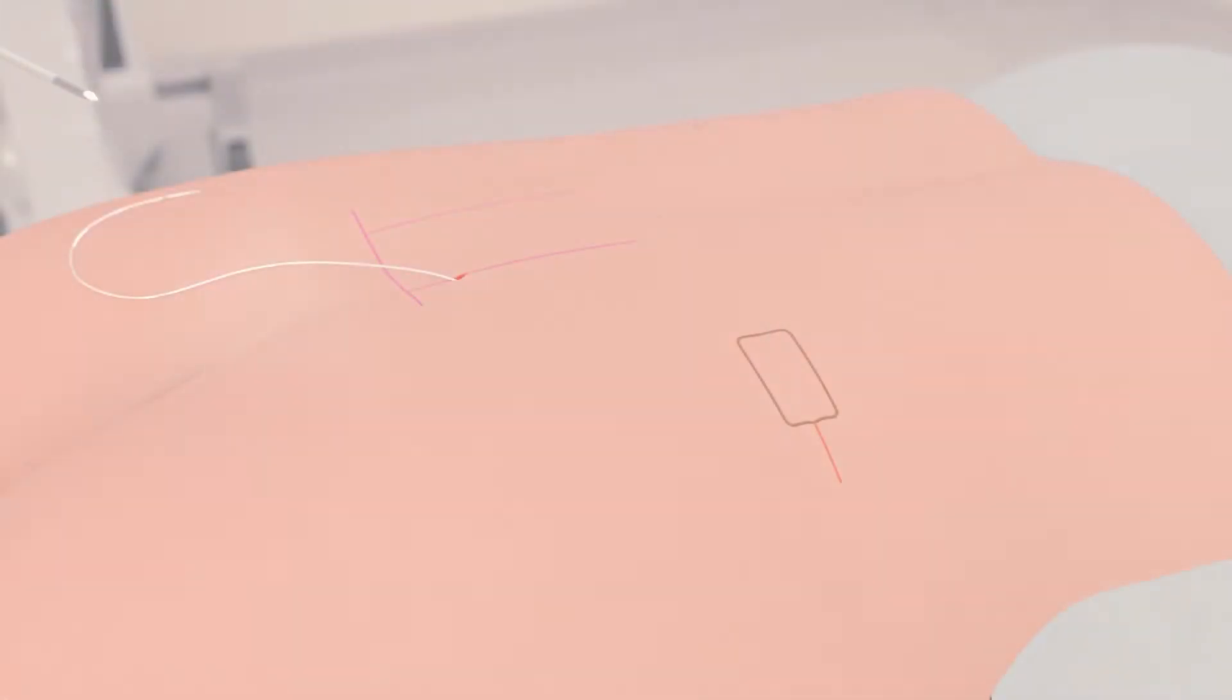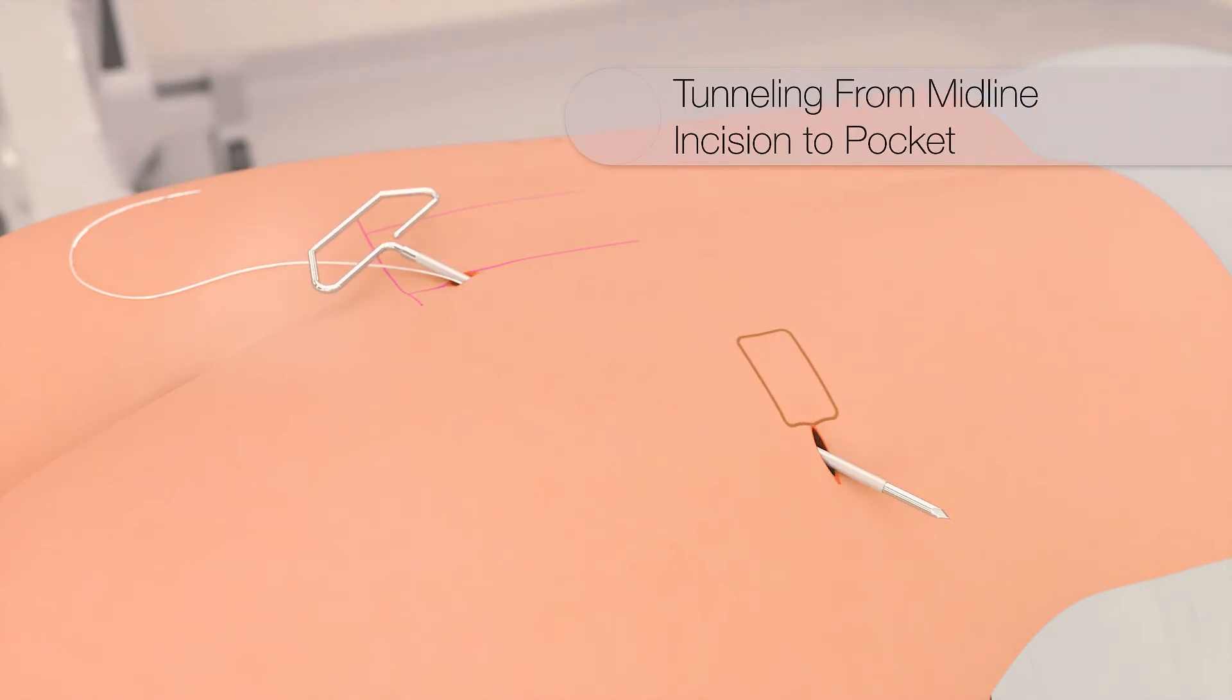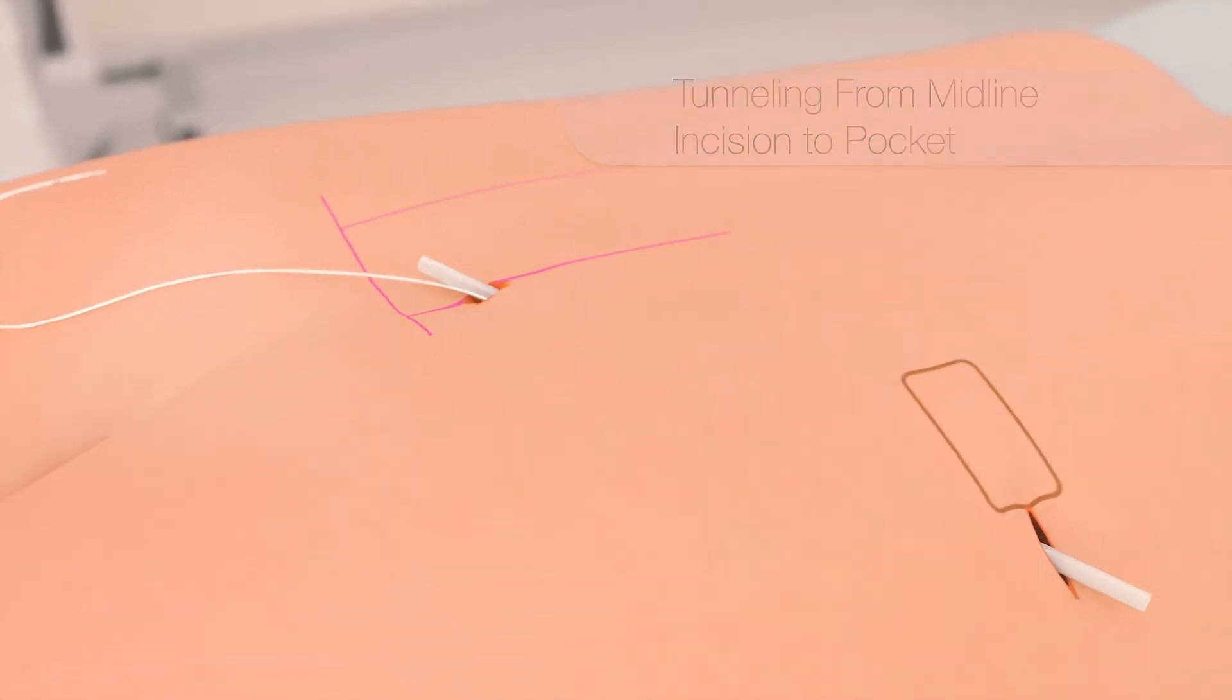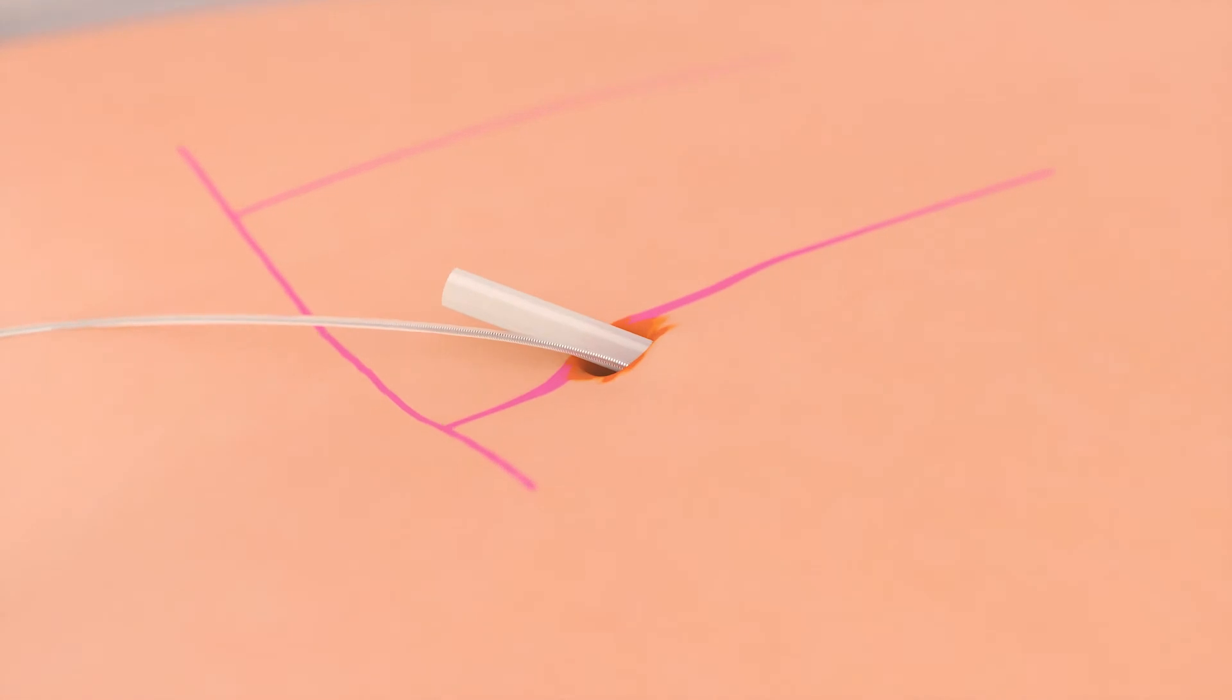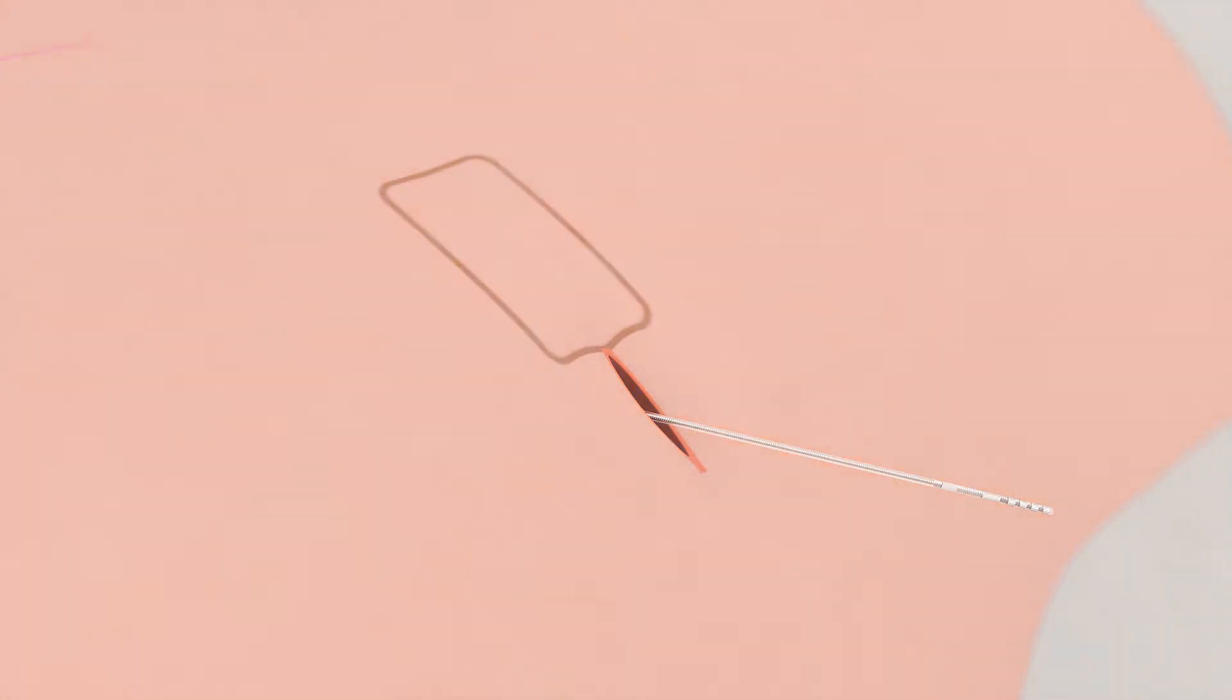The tunneling tool is used to tunnel from the lead entry point to the incision. The sharp tip and the handle are removed leaving just the clear plastic straw. The lead is then placed through the straw and brought out through the lateral incision. The straw is then removed.